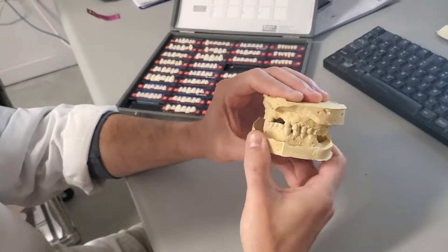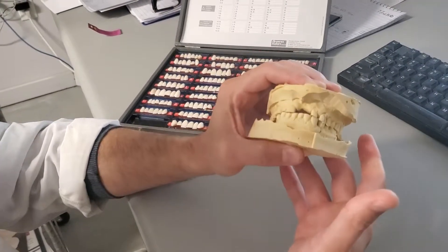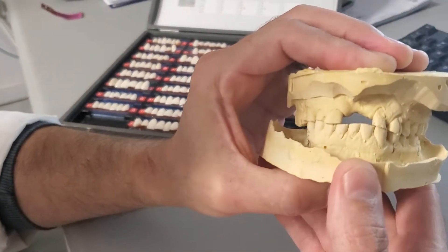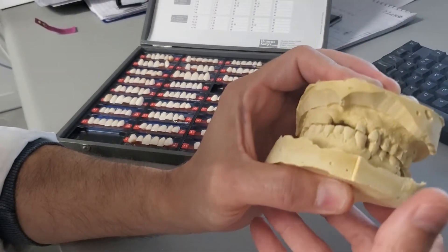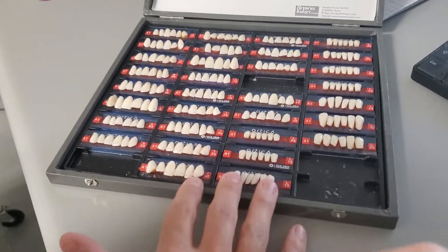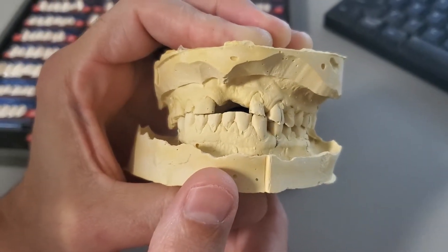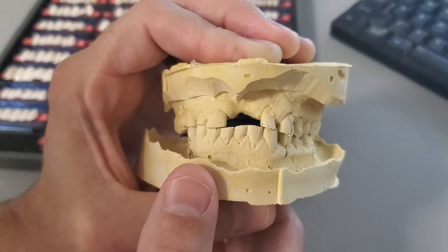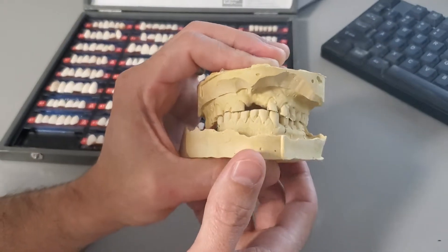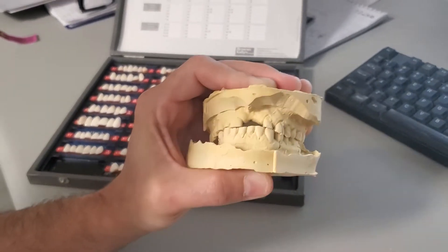This is an interesting case — we need to make an acrylic partial, or a flipper, replacing tooth number nine. Obviously we're going to have a diastema, and normally when we make a flipper we've got these teeth to choose from, as you can see. But no standard tooth is really going to match tooth number eight. So what we decided to do on this one — and it wasn't the quickest or the easiest thing to do, but it's the right thing to do.